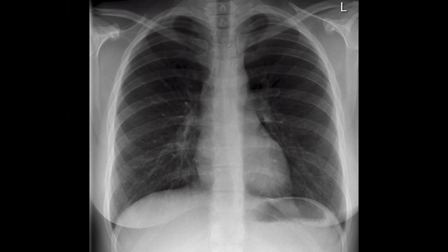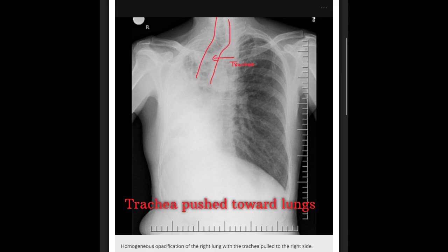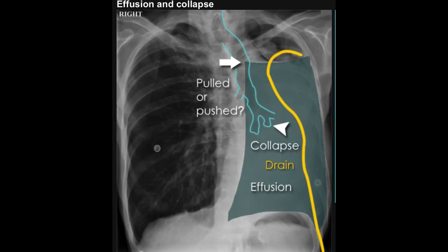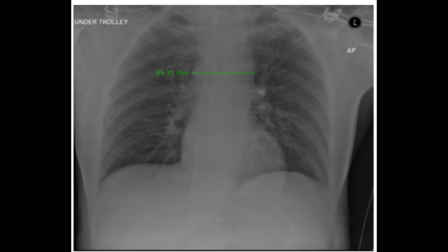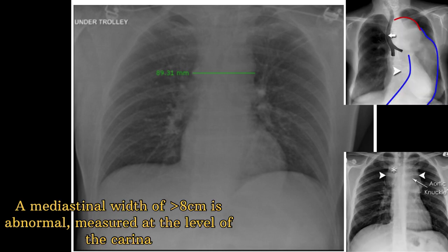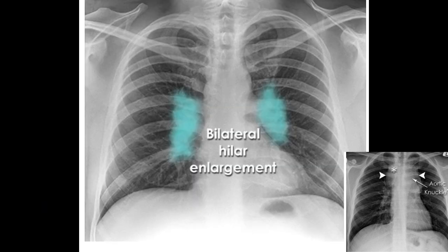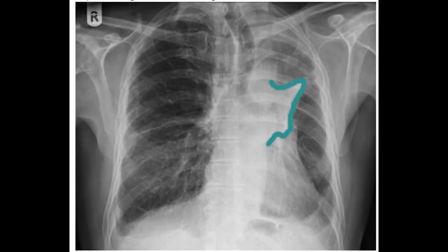That's what a normal chest X-ray looks like when you go step by step. Now let's use the same ABCDE system to spot abnormalities. For abnormal airways and mediastinum: if the trachea is pulled towards the lung, there may be collapse or fibrosis; if pushed away, suspect effusion or tension pneumothorax. A widened mediastinum suggests aortic aneurysm, dissection, or trauma. Hilar enlargement is usually seen in lymphadenopathy and pulmonary hypertension.